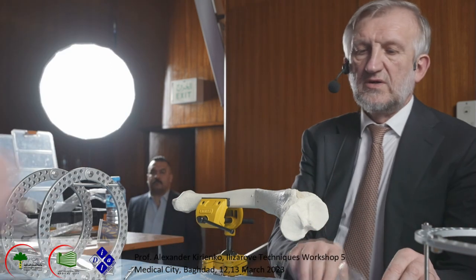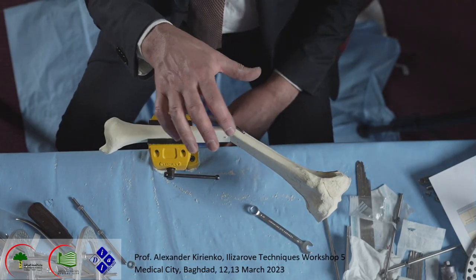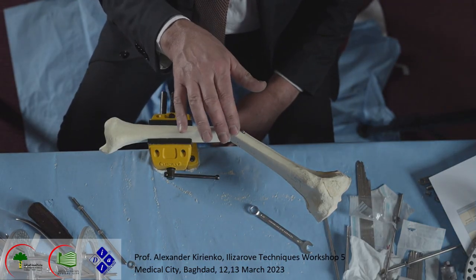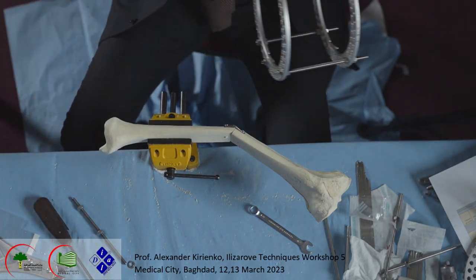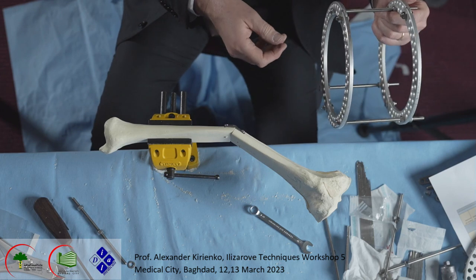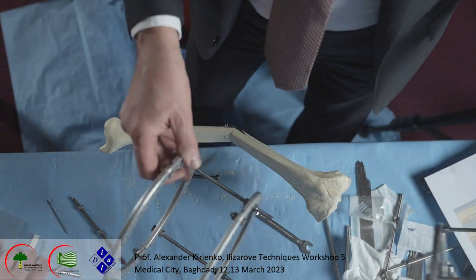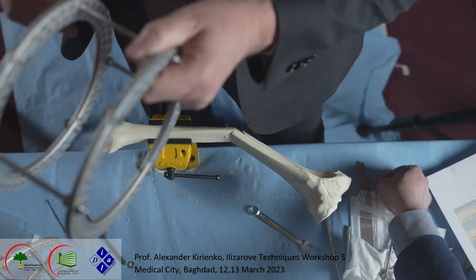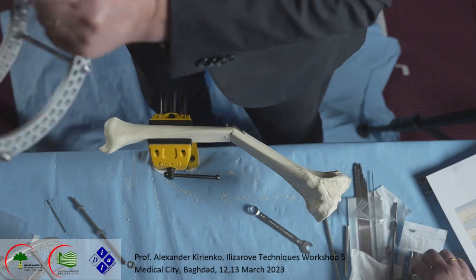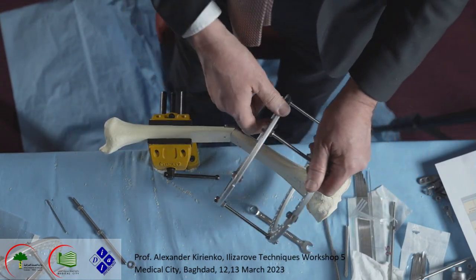What we do, we need to program the frame that has the hinges exactly at this level of deformity. With the osteotomy, this hinge permits us to do the correction of the deformity. What we use? Like before, we use two systems, each composed of two rings, one proximal system and one distal system.